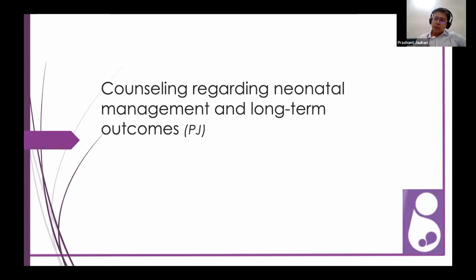If microcephaly is there along with temporal cysts and ventriculomegaly, then the chance of CMV would be more than other genetic disorders. Else you can have some sort of a lissencephaly-like pattern, which can have a genetic predisposition.